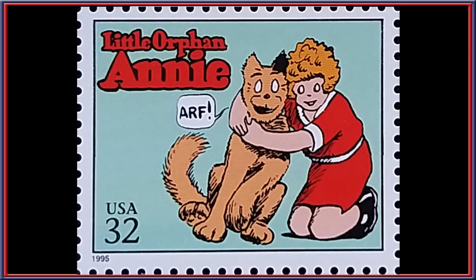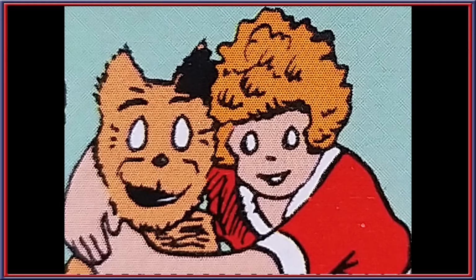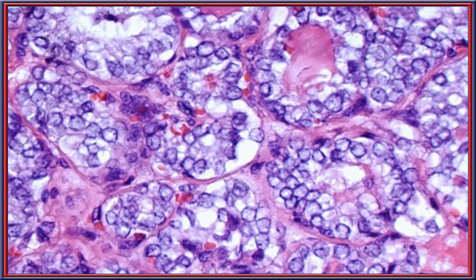However, let's just look at the nuclei, which of course are represented in the eyes. And if you go up to high power, which is what pathologists like to do, I think you can all see that there is this incredible margination of the nuclear chromatin out towards the periphery with a central area of optical clearing. And it is in both the dog and the girl. So we know that this is not just a fixation artifact, it is a genuine finding in these particular nuclei.